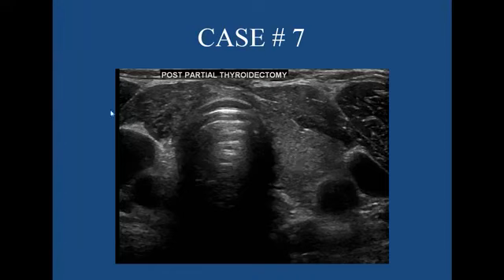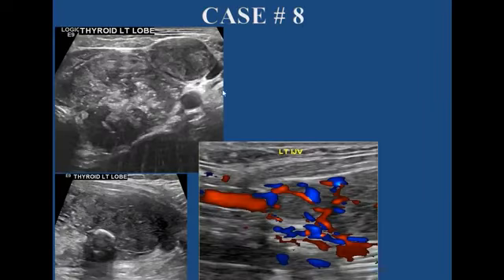Here the patient in the follow-up. This is the right lobe, and this is the left lobe of the thyroid. Here we have a nodule, and what we can observe by visual inspection is that the AP diameter is greater than the width, and this means invasion.